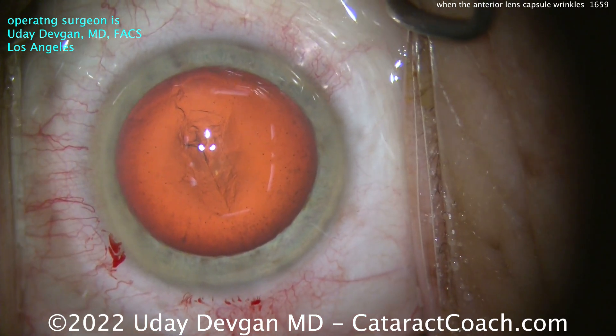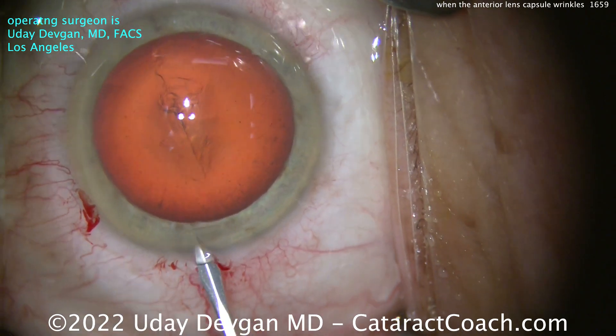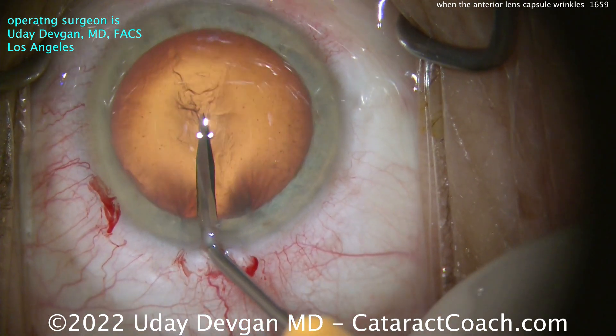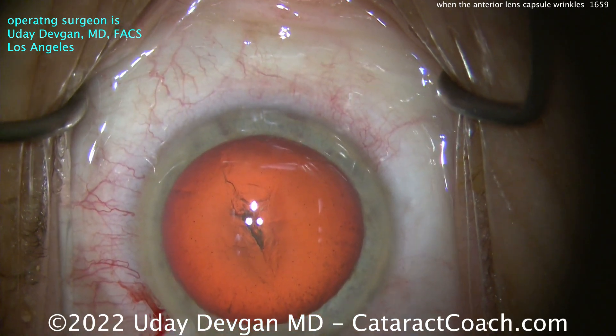This is where a cystitome or bent needle may help, but I don't have one on the field right now. So I'll just use that same side port blade from the beginning, wiggle it there with the incision. That's nice and sharp, and from that I'll just poke into the lens capsule, and then we can get the capsule flipped over.